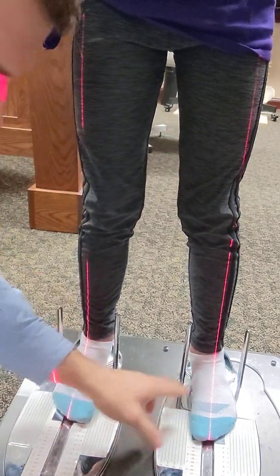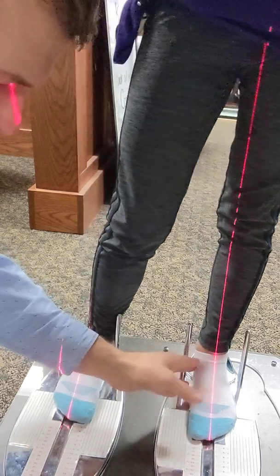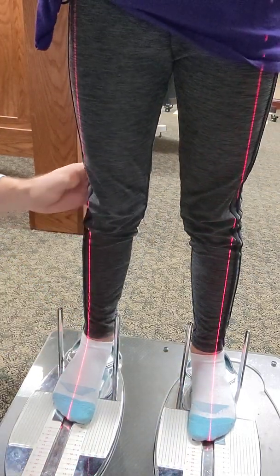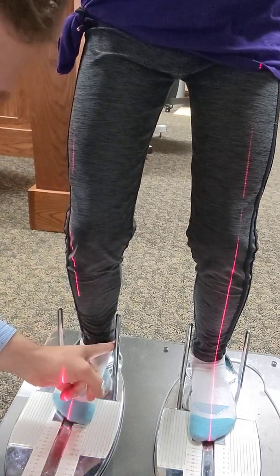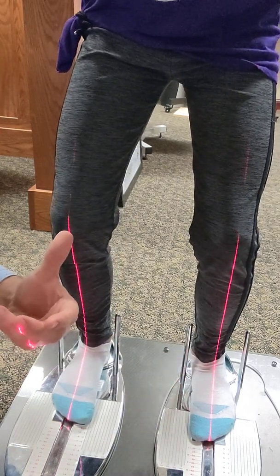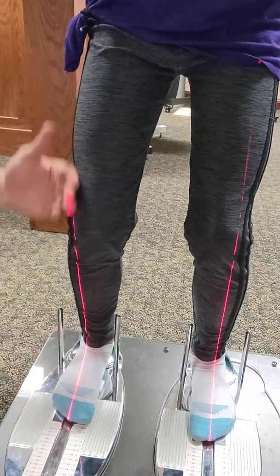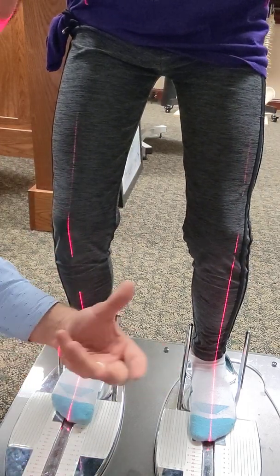You can see what we're dealing with — how over-pronated that foot is. Go ahead and stand just like that, Kai, and just let them see it. Go ahead and put a five-degree bend like you're in snow boots. So the issue is looking right through here. Now, a flat foot is a fast foot, but at the same time it's going to cause knee issues down the road if we don't correct this and get her to more of a neutral stance.